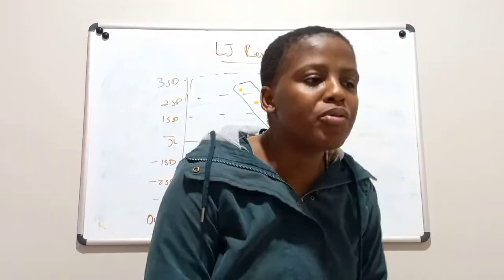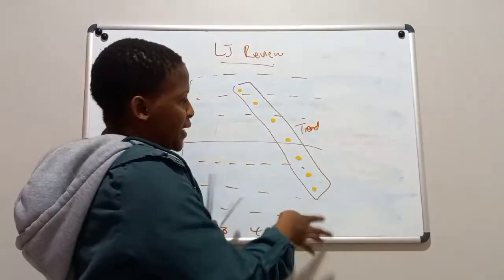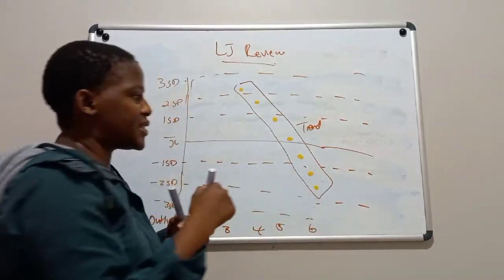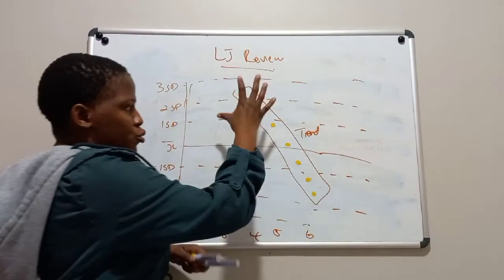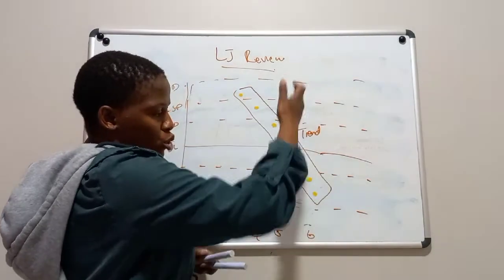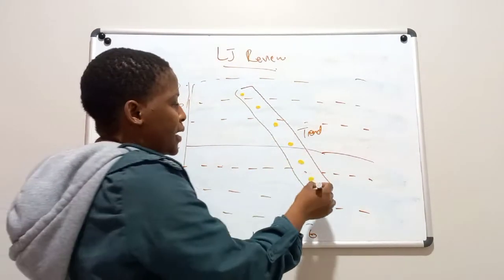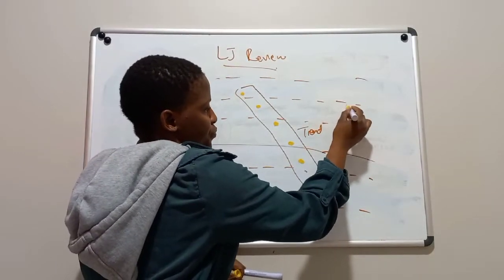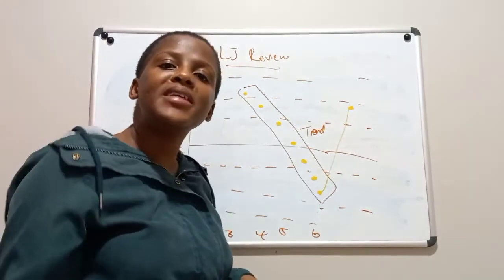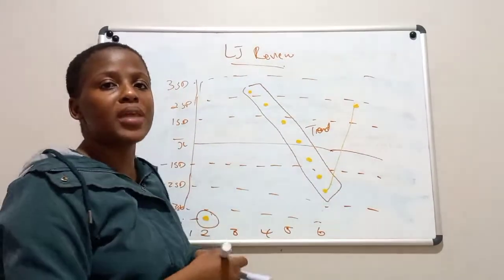Another thing that they will look at is shifts. So shifts, it's when you have, let's say we're having a trend here. From this point on day 6, you probably calibrate because you saw this trend, and you were querying the calibration status, and you decide to calibrate your cal stability. So after calibrating, when you run your QC sample again, your values shift to the other side. So it's a movement from one side of the mean to the other side of the mean. Basically we'll define this as a sudden or abrupt change of points, whereby they move from one side of the mean to the other side of the mean.